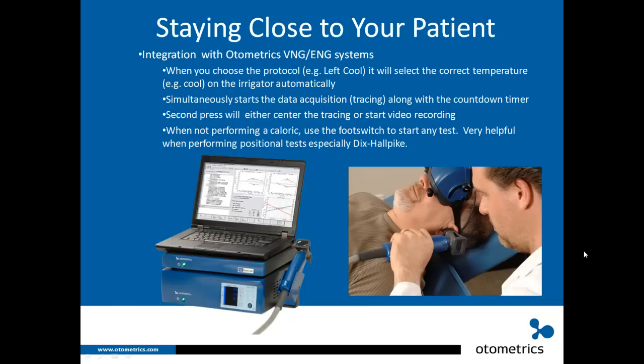The AirCal integrates with the Otometrix VNG/ENG system — either the Charter 200 or Hortman Vestlab. When you choose a protocol, for example left cool, it automatically selects the correct temperature on the irrigator. As the protocol advances to warm, the irrigator automatically switches to warm. Pressing the button on the delivery head or foot pedal simultaneously starts data acquisition tracing and the countdown timer. A second press centers the tracing or starts video recording. The foot switch can also be used to start any test, which is especially helpful for positional tests like Dix-Hallpike.